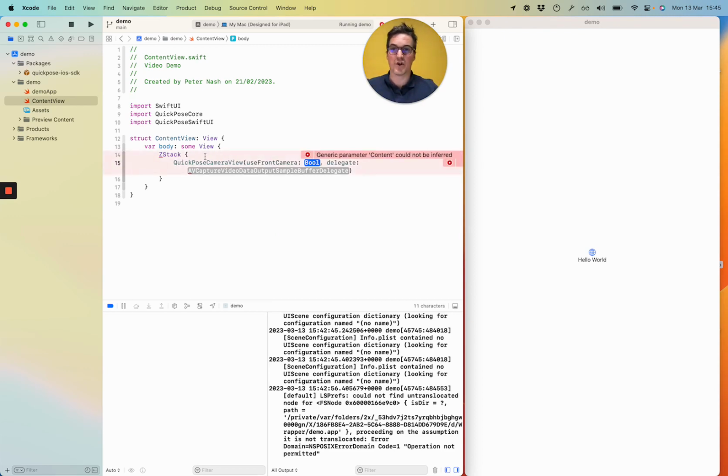What I want to do though is load the simulated camera view, because we'll be developing this on my Mac, and my Mac is a Silicon Mac, which allows me to run it natively. I strongly suggest developing on the new Silicon Mac, because as you'll see, it really reduces your development time. So just a bit of boilerplate here. I think front camera true is fine for now.